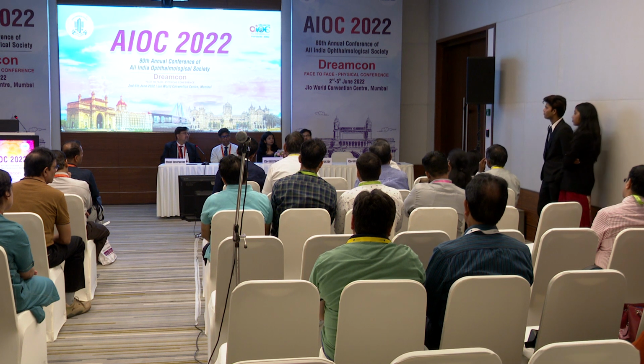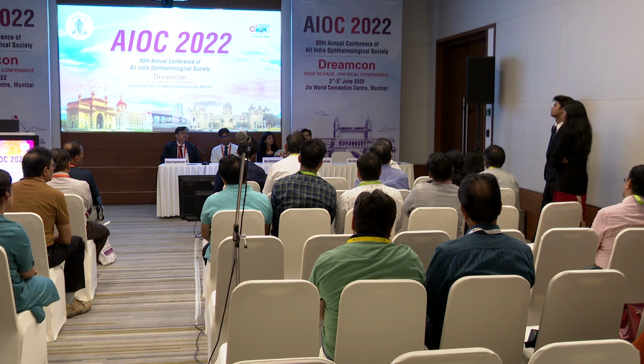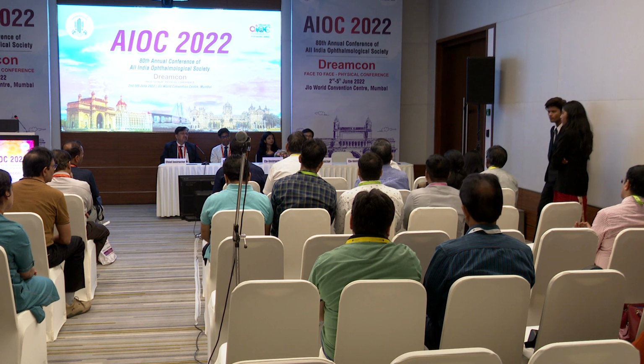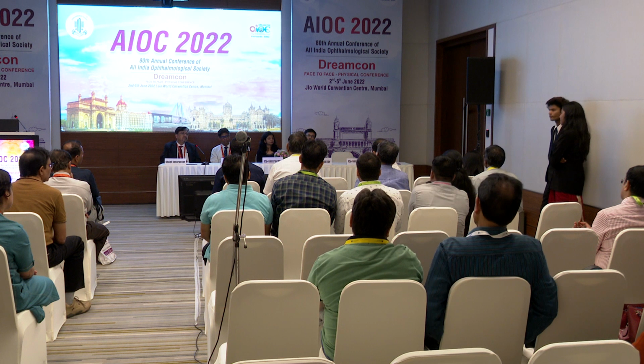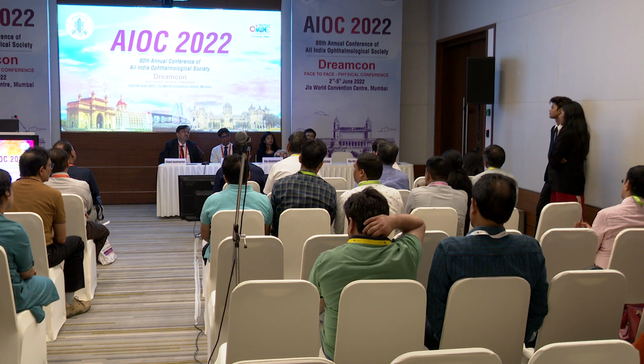But the endotoxin that is there, so if there is a sizable load of Pseudomonas aeruginosa, even if you have killed everything, the endotoxin that is deposited on the instruments cannot be killed even at very high temperatures. So they survive and they can cause TASS. So it is very important to have good quality water for cleaning the instruments and for running in the autoclave.